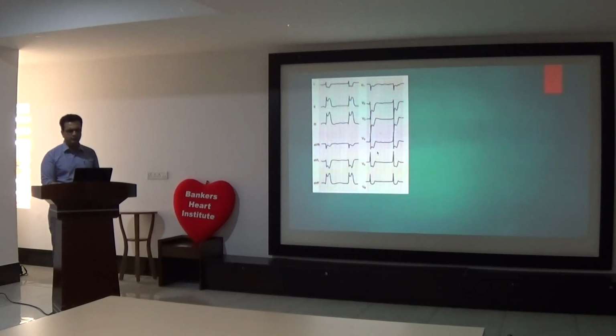Next, as the standard 12-lead ECG does not view the posterior wall, if there is significant ST depression in V2, V3 and V4, it can be said that the patient has posterior wall MI as well. Thirdly, V1 is the septal lead and there is discordance: there is no significant ST depression seen in lead V1 as compared to leads V2, V3 and V4, as the right ventricular infarction injury vector will try to pull the ST segment upwards.